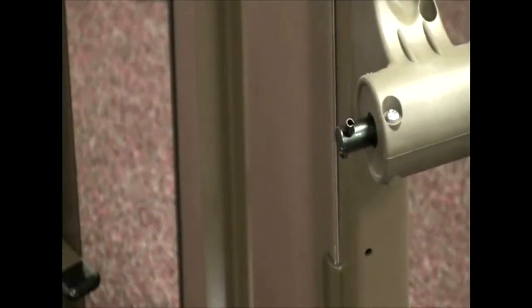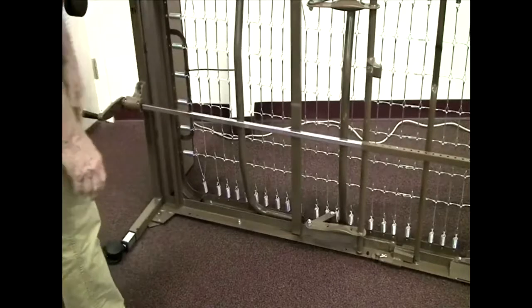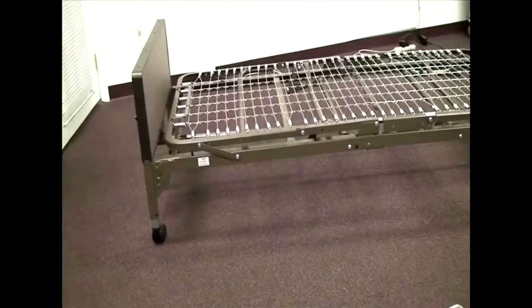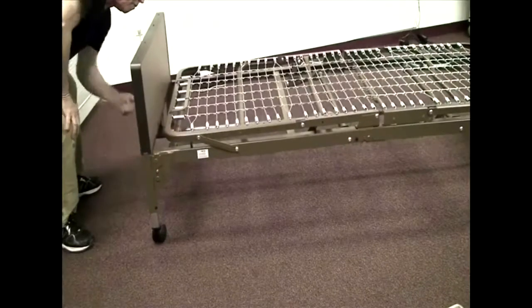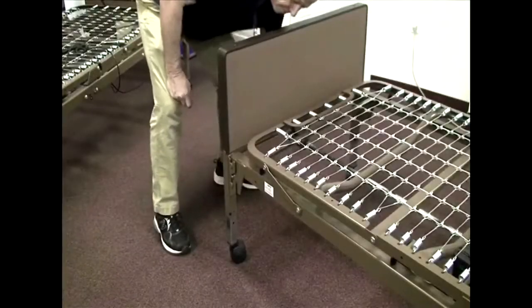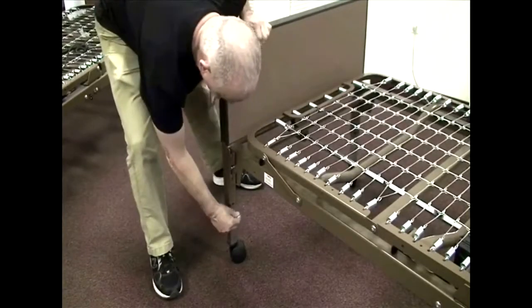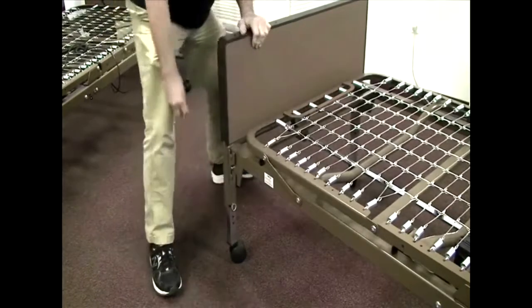Underneath the headboard you'll find a gearbox with a shaft sticking out with a pin through it. Take the end of the high-low bar and slide the slots over that pin. Then take the other end of the high-low bar, compress it, and slide the slots on that end over the pin on the footboard. Now take the hand crank and crank the bed up, making sure it moves up evenly both side to side and end to end. Crank the bed to the desired height, then take the four pins with rings attached and insert them into all four legs at the highest hole available as a safety measure.